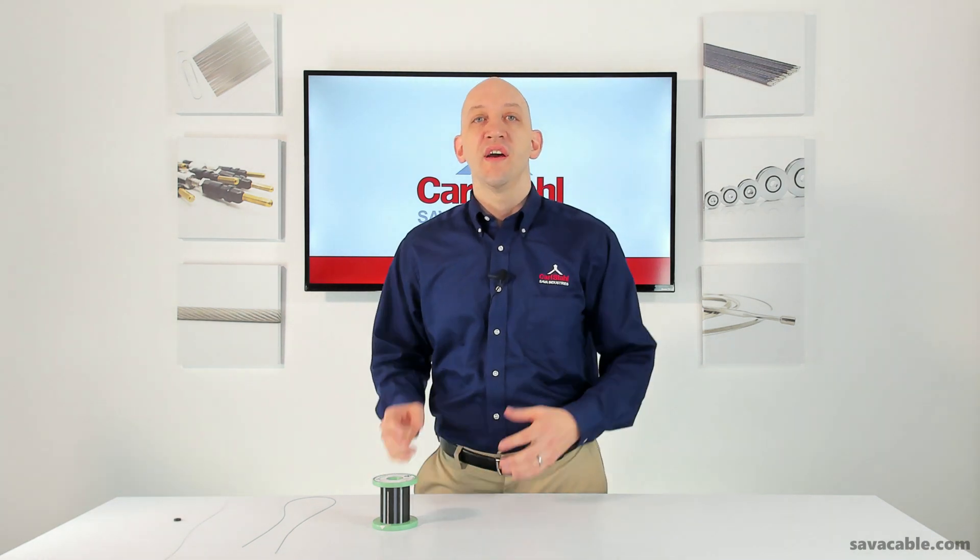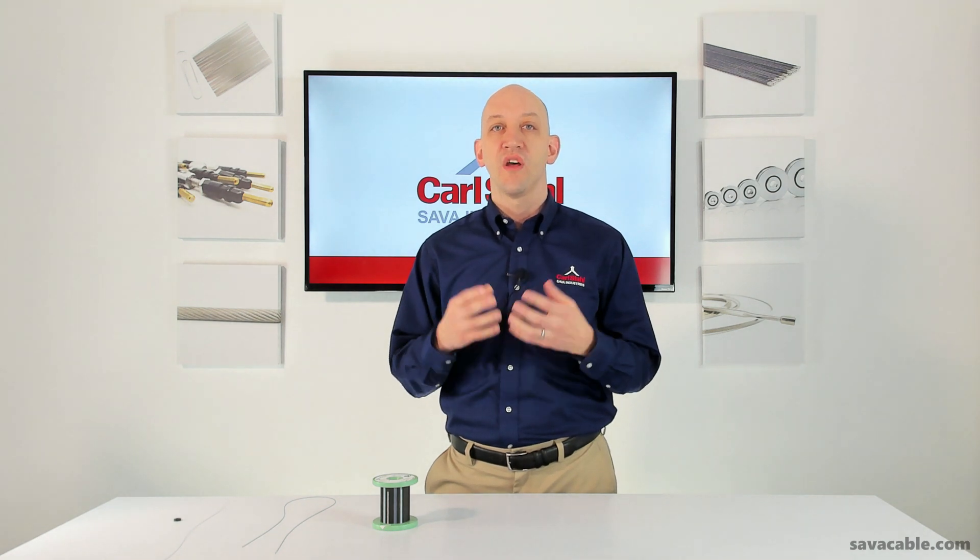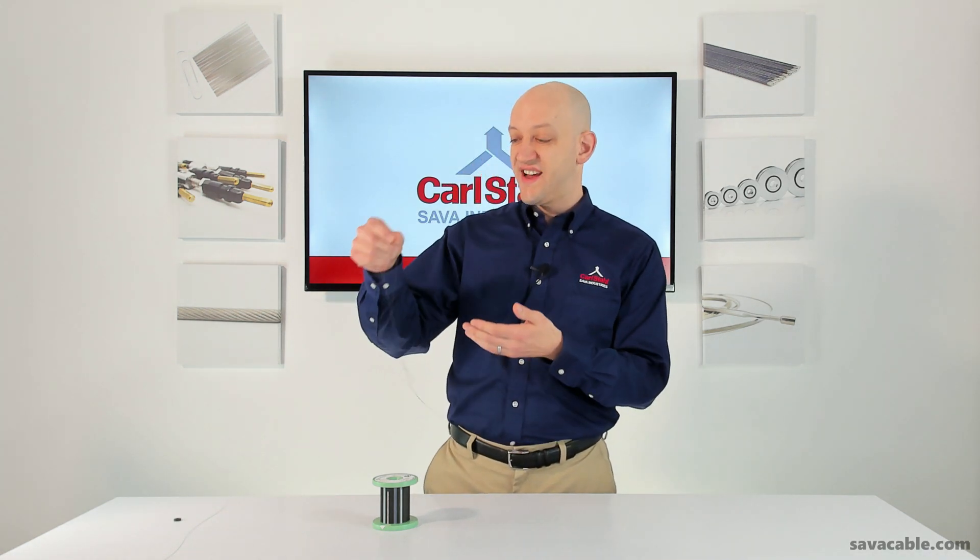Another advantage of using this ultra-fine wire is we can manufacture cable constructions using 200, 300, up to 700 wires and still maintain a very small profile. This has advantages in flexibility — I'll show you here with this cable that has 259 wires in it. You can see, as it falls off my hand, it's dead, it's lifeless. It'll bend in any which way you need it to.